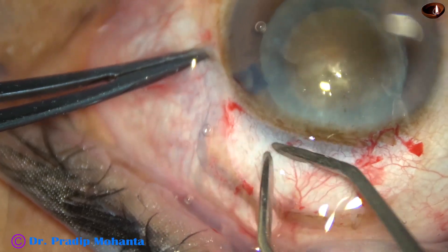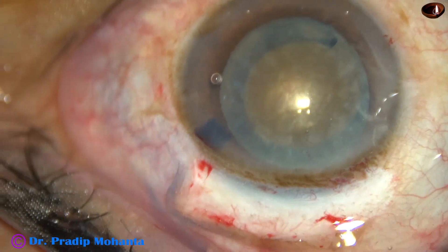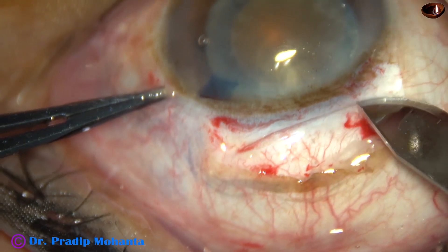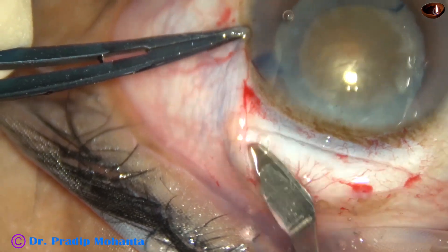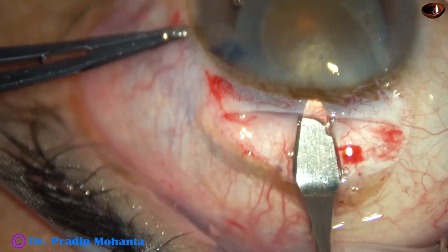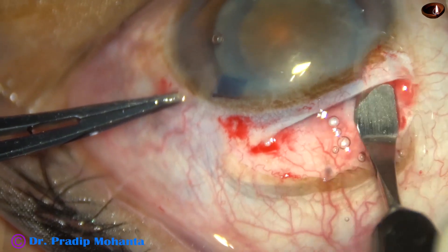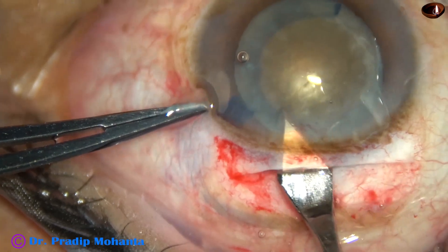Mild cautery is done — we may not always do cautery. In this case, the assistant has to pour in saline or Ringer's lactate. The tunnel is made with a crescent blade. Making the right tunnel is one of the most important steps of SICS. If we hurry up, we may cause problems like premature entry or a very thin anterior wall of the tunnel. So, to make the right tunnel with a good corneal valve, we have to dedicate some quality time.